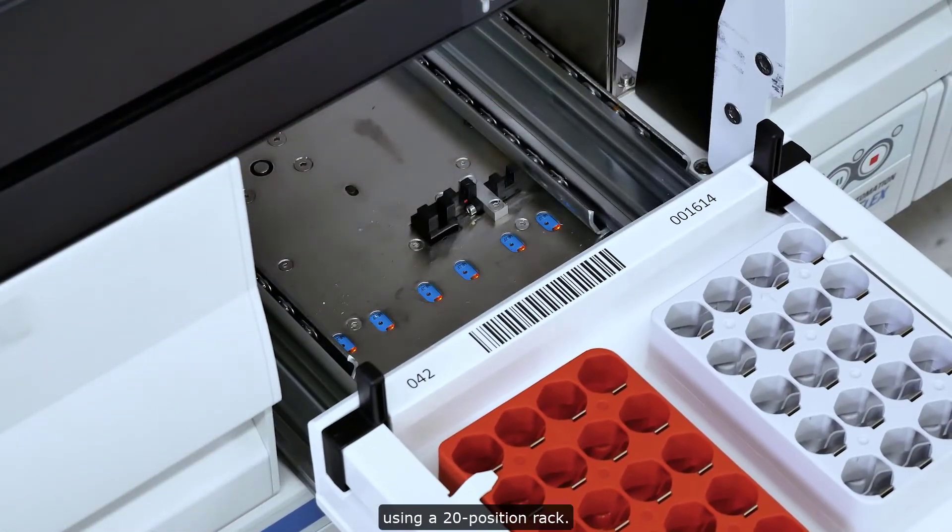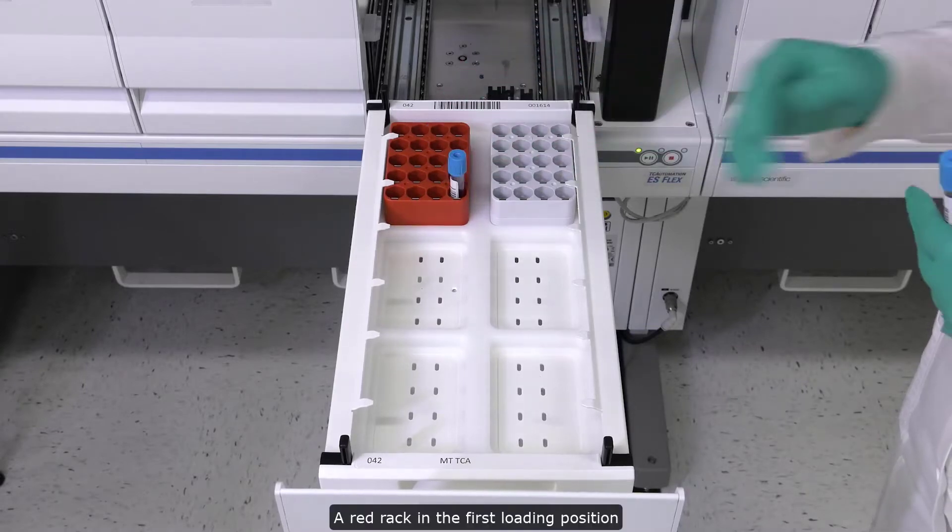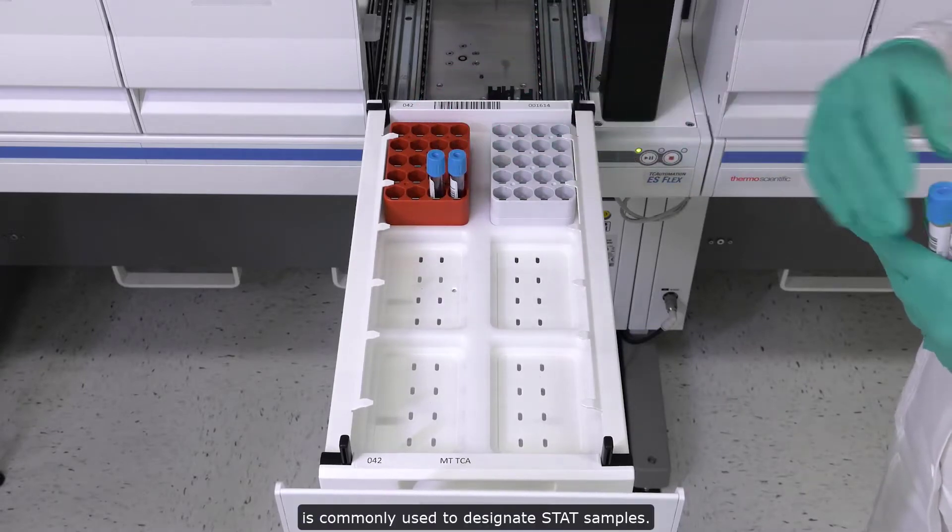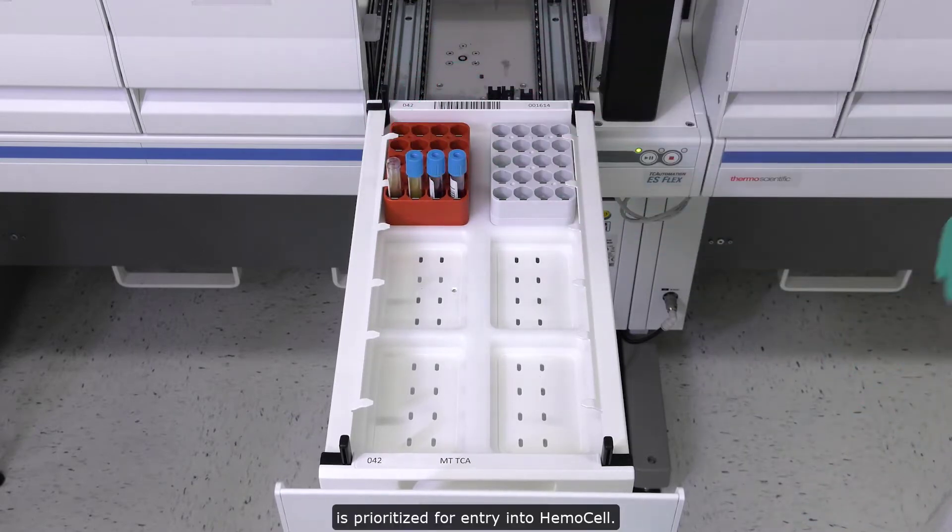Samples are placed on board using a 20 position rack. A red rack in the first loading position is commonly used to designate stat samples. This loading area is prioritized for entry into HemoCell.